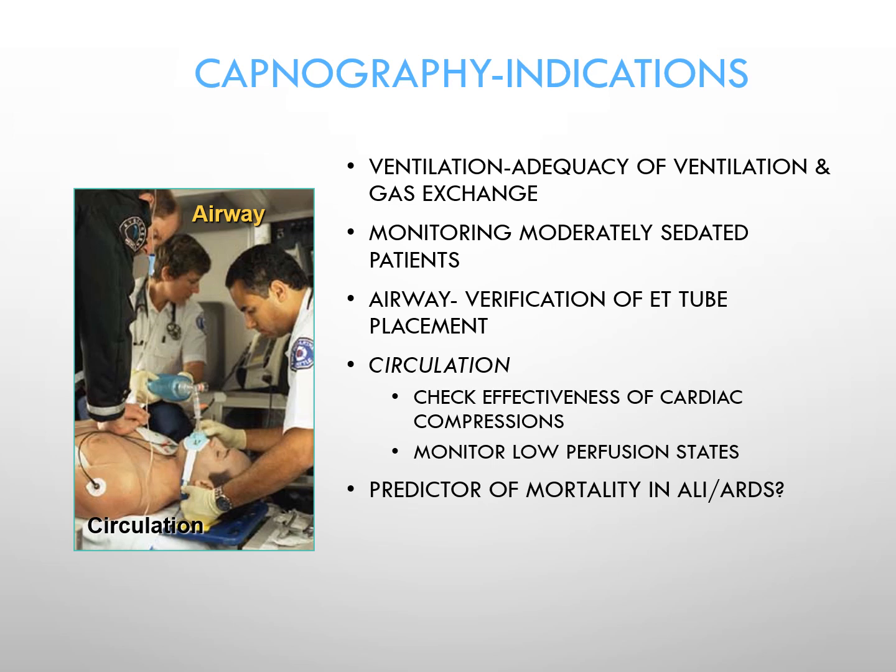In addition, and as a point that I just alluded to, is monitoring patients who are moderately sedated. The term used to be conscious sedation, but we've gotten away from that. Generally speaking, when medication is administered to sedate a patient to facilitate, say, an endoscopy, a colonoscopy, or a bronchoscopy, those medications are given to achieve this moderately sedated state, like a twilight sleep.